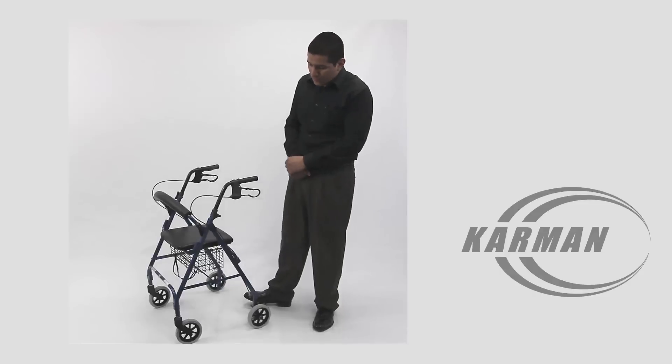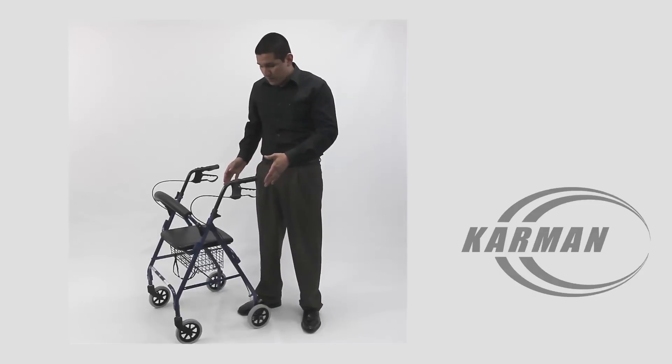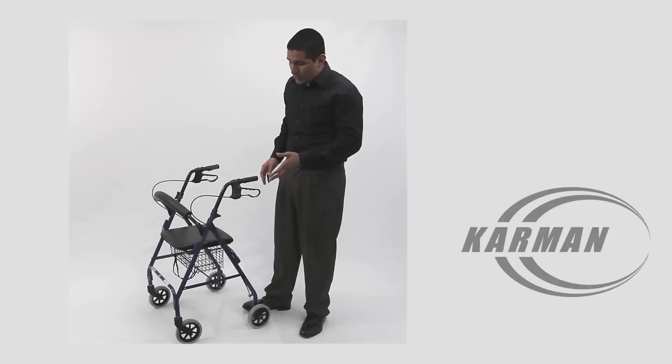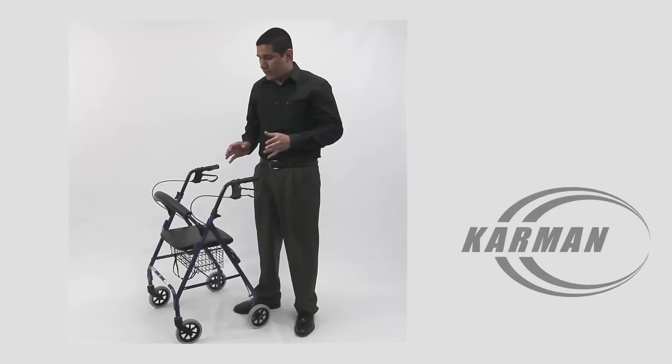This rollator comes standard with 6 inch casters. The reason why we do 6 inch casters here is because it actually helps you go up a curb, prevent you from getting stuck on big pebbles or big rocks. So it's really great for daily aid in the streets or on carpet.